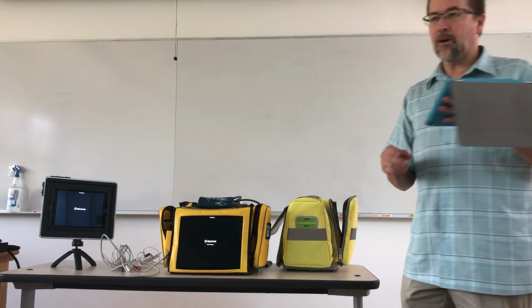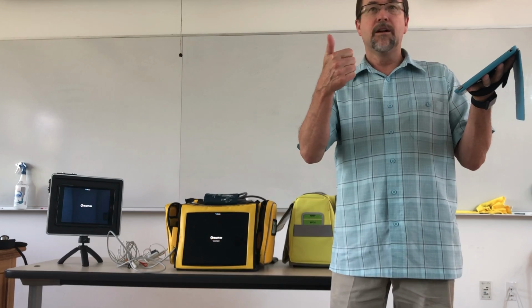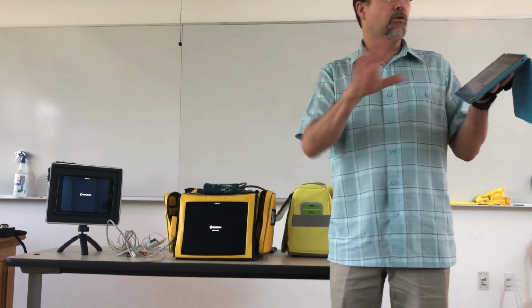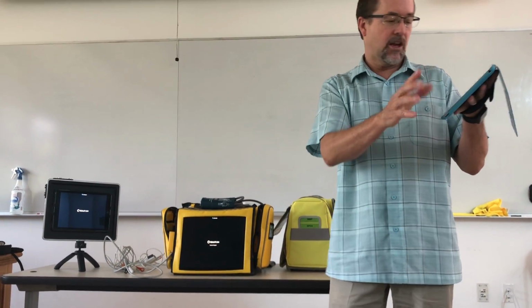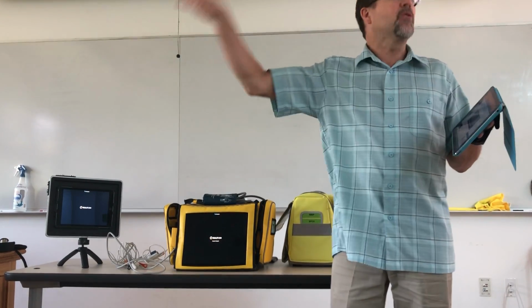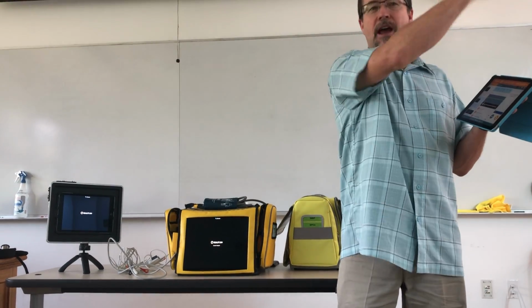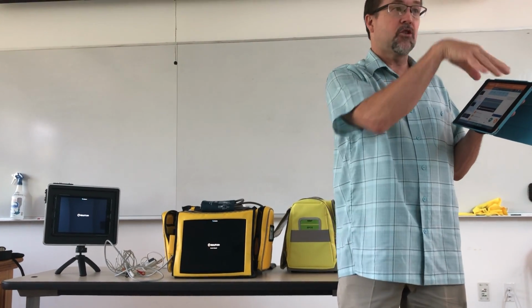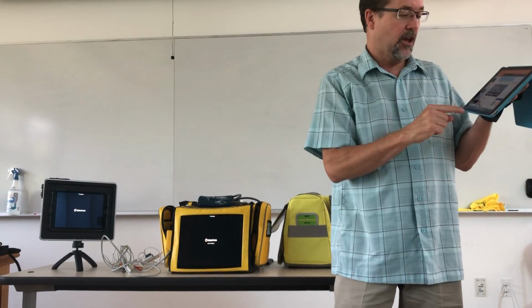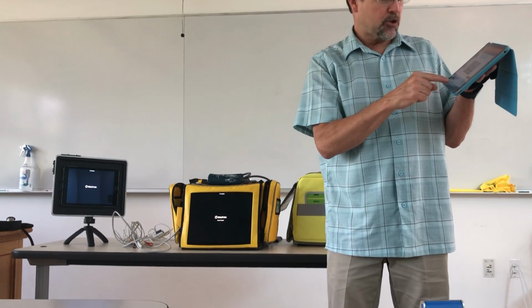So there is, at the bottom, there's also the buttons. You can load a new scenario, and it just dumps you out of that, and you start over with the next person. If you're not saving anything, you can print it, which dumps it into the file where you can go get it later. So you don't have to print it right then. You're just saying, I'm going to want to print this, so that you now have it to do as a PDF, to airdrop, to do whatever it is you're going to do with it. And then transfer video is the last one. So you can capture the video.